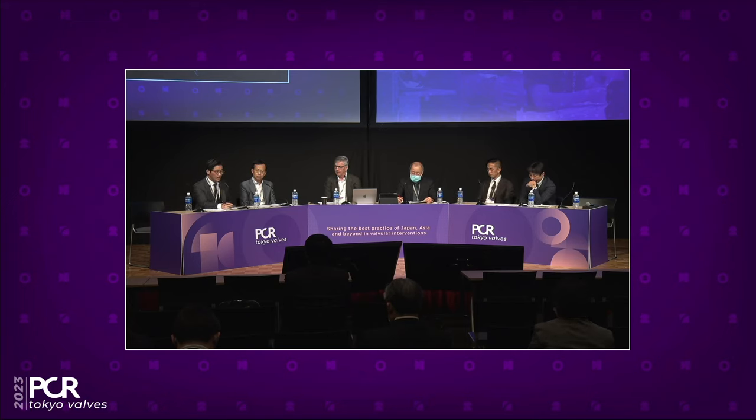Thank you very much, Lars. Actually, if the patient has really excessive calcification, we may have some risk of PVL after the procedure, especially if the patient has LVOT calcification, that's a huge risk for PVL. And for the patient that Dr. Moriyama demonstrated, of course, we can find severe heavy calcification on the leaflet, but it's still doable.